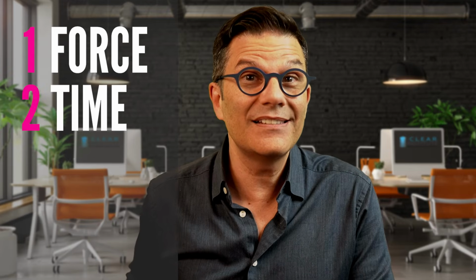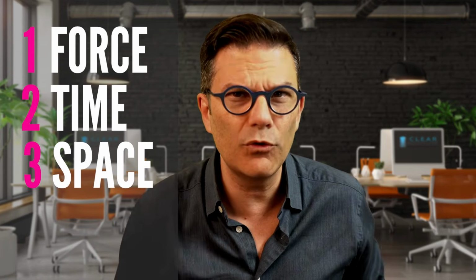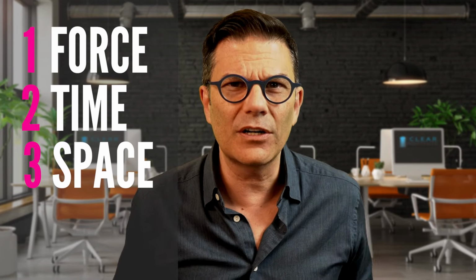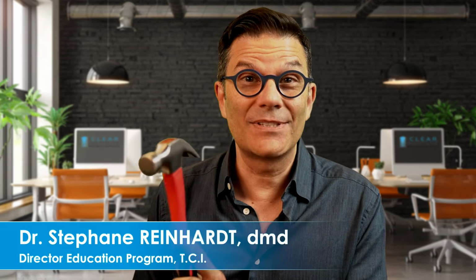What do you need to move teeth? You need force, you need time, and you need space. So again, don't get me wrong. I'm not saying to remove 1 millimeter of IPR between all the teeth. I'm not even telling you to do IPR. I'm telling you if you're comfortable with the IPR, now you have another option, another trick that you can put in your toolbox.